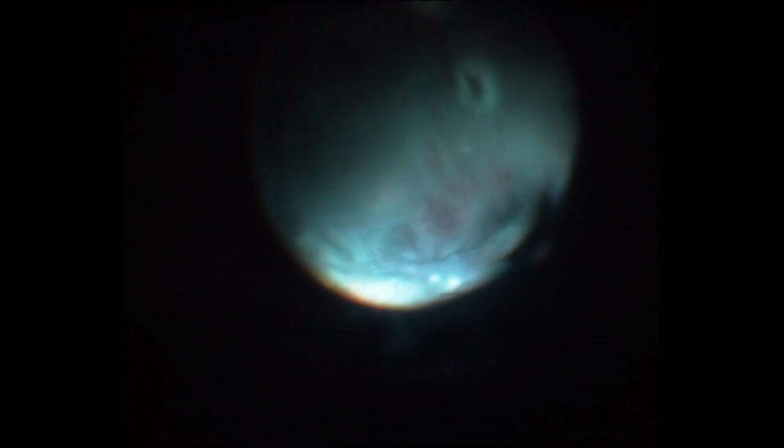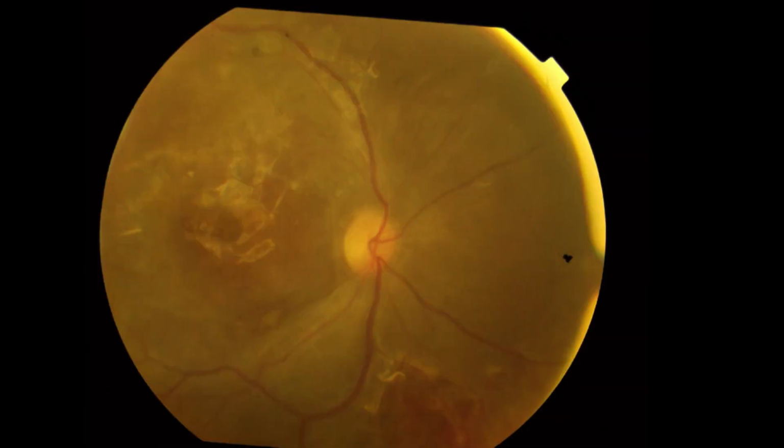Subretinal fluid was removed actively using the blunt tip 25 gauge cannula. Lastly, the inferior retina and retinotomy were lasered adequately. This was followed by injection of additional silicone oil to provide adequate retinal tamponade. Post-operatively, the retina was successfully attached at 2 months of follow-up with best corrected visual acuity of 4/60.